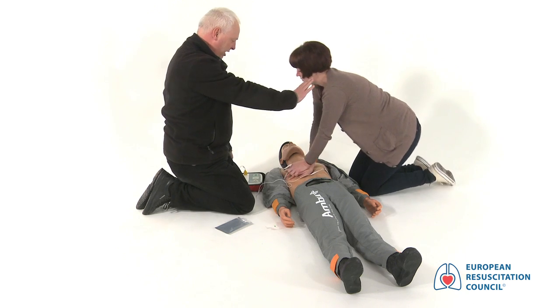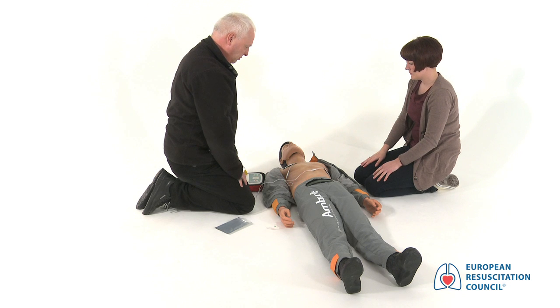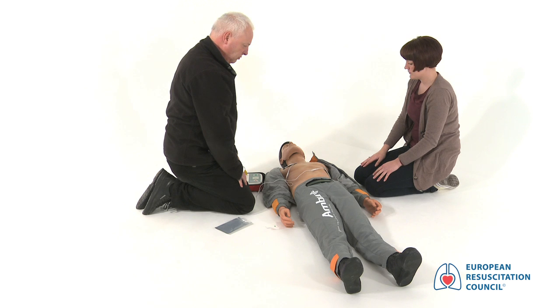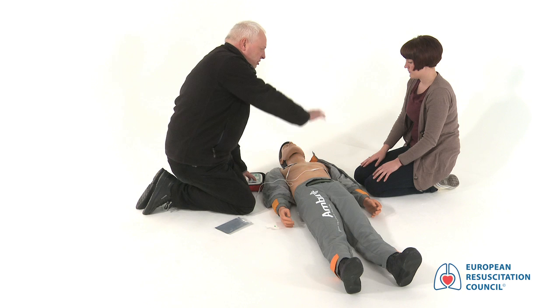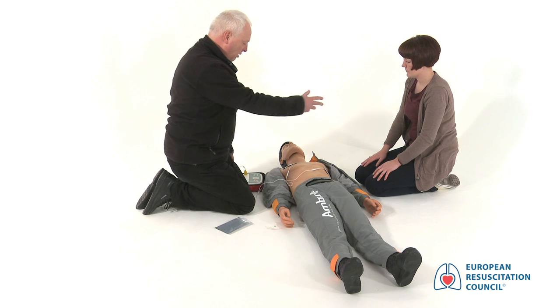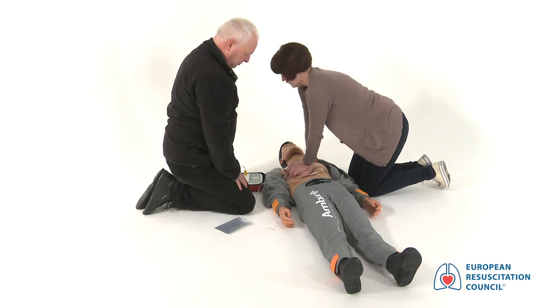Analyzing heart rhythm. Do not touch the patient. Shock advised. Charging. Stay clear of patient. Deliver shock now. Press the orange button now. Stand clear. Shock delivered. Begin CPR. The second person should direct the first person on when to stop and restart CPR. The second person should take over delivering CPR after two minutes to prevent fatigue. Both rescuers exchange roles every two minutes.